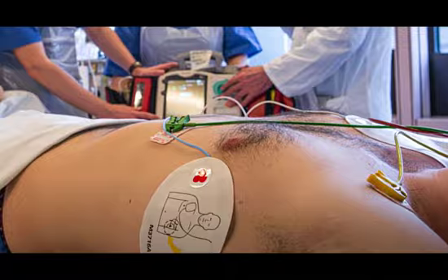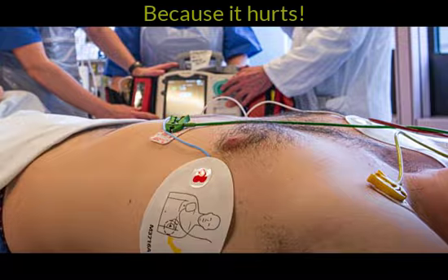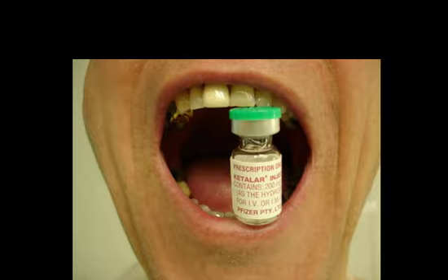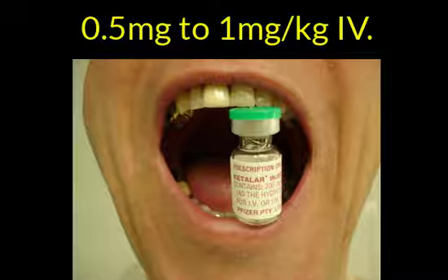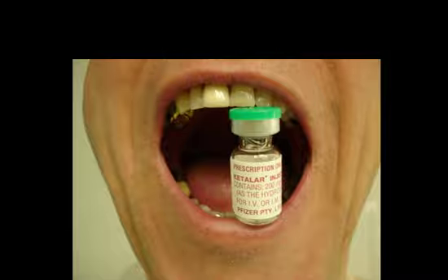So, explain to the patient what's going to happen. Then give analgesia and sedation. Personally, I strongly prefer ketamine IV at a dose of around 0.5 to 1 milligram per kilogram. It works, and you don't get those pesky airway issues that narcotics and benzos bring.